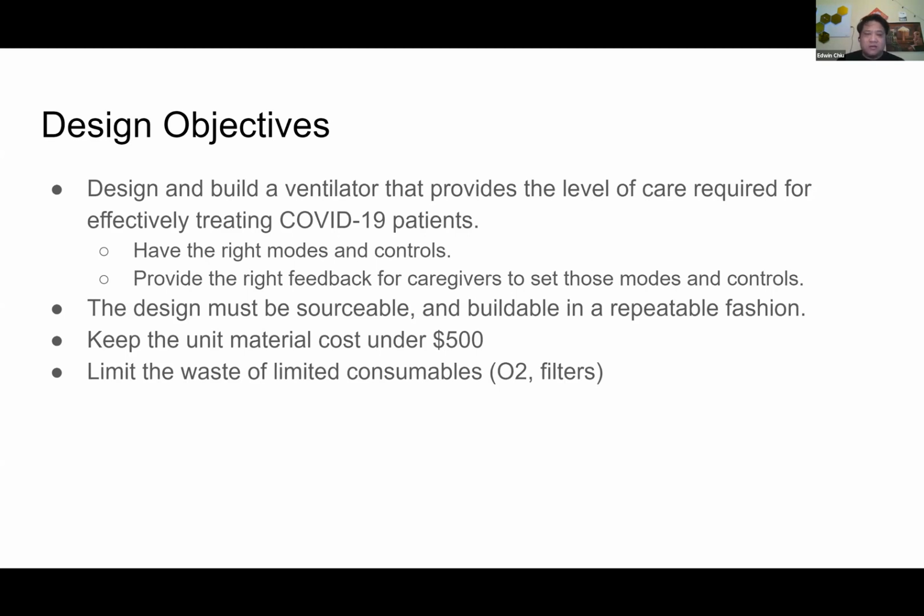A lot of the other designs out there are bridge designs. They're intended to help keep a patient alive when they enter the hospital, but they will most likely end up being transferred to what is considered a full-featured ventilator. So we want to build a ventilator that has those features so that we don't end up taking up another ventilator eventually. The design must also provide the right feedback for the caregivers to be able to set the course of treatment to bring people all the way back to recovery.